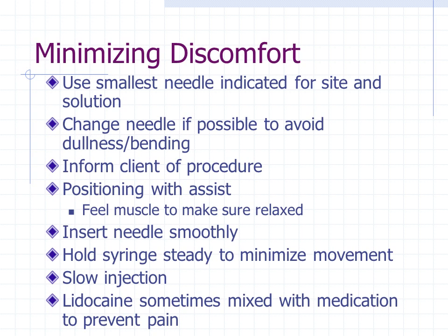Insert the needle quickly and smoothly. If you go slowly, it's going to hurt more. Go quick and get it over with. Hold that syringe steady to minimize movement of the needle. Inject slowly. Sometimes lidocaine will be mixed with the medication to help prevent pain.